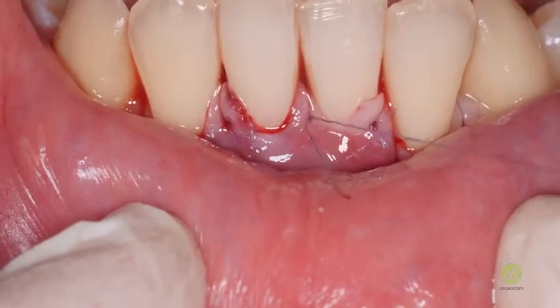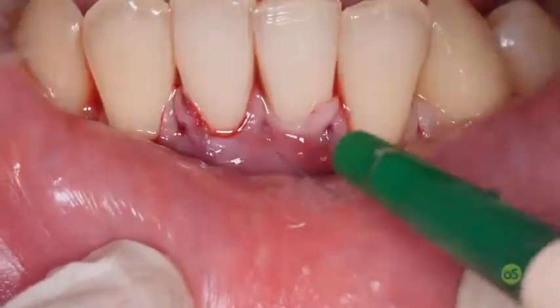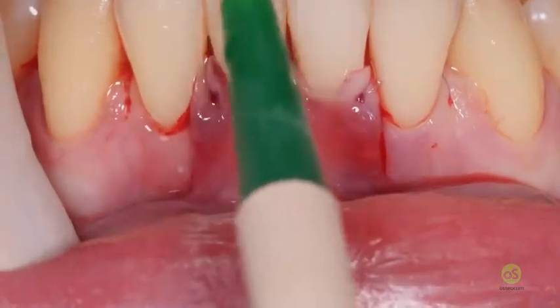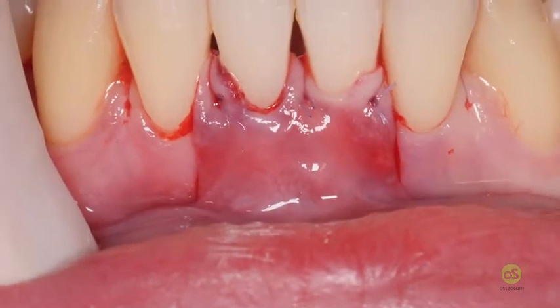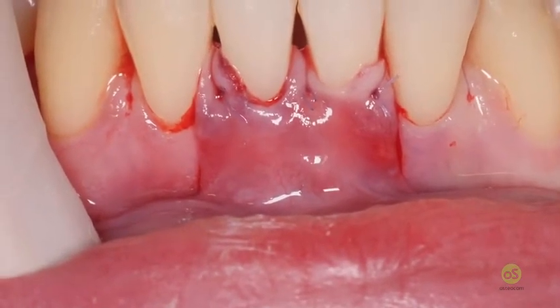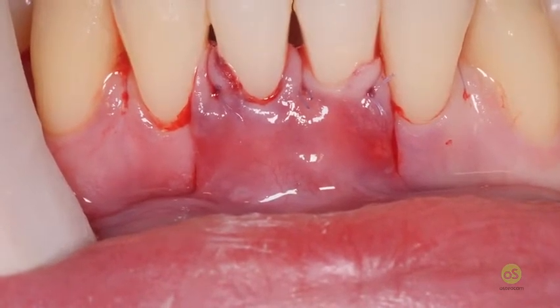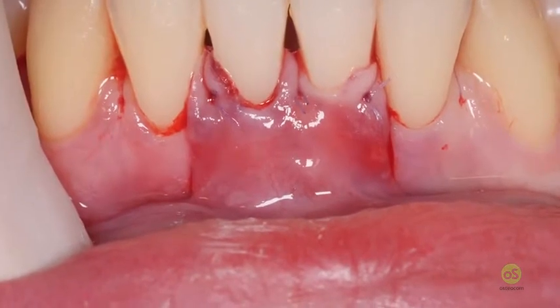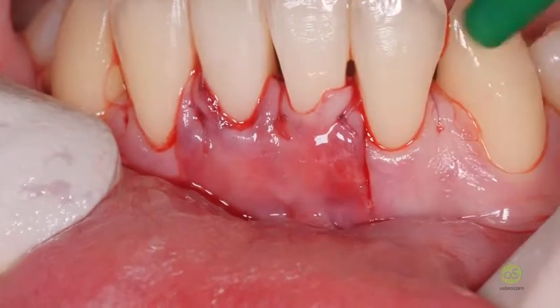So that the papilla now is in the final position. And it's time to see the verticality of the vestibulum depth and to anchor the flap to the periosteum. We always start at the level of the smallest recession where the vestibulum depth is easier to be replaced. It's very important here to pull the lip but leaving the flap vertical.